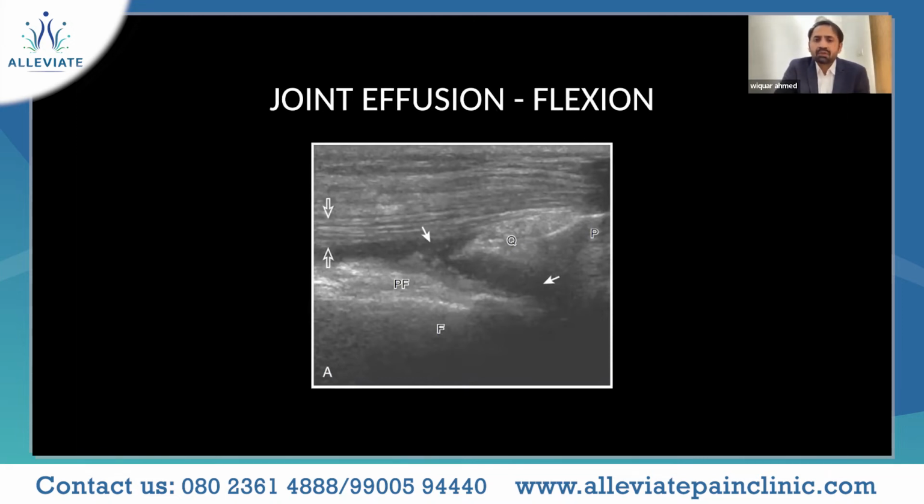Again, the suprapatellar aspect, wherein the structures which you can see and what defect is there is most important. This is the quadriceps tendon which comes and attaches to the patella. It has 3 layers. The uppermost, the most superficial, will be your rectus femoris, then vastus medialis and lateralis, and intermedius in the end. That is the deeper structure.